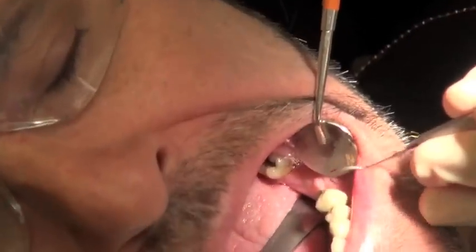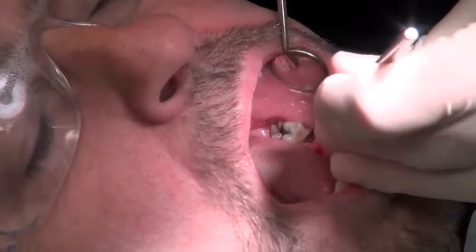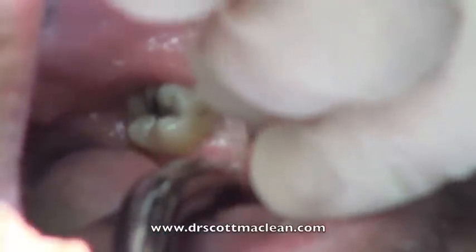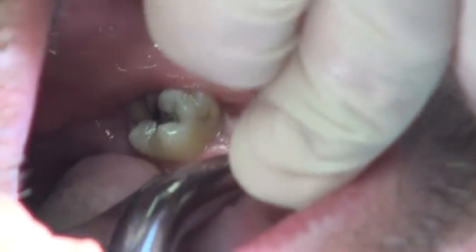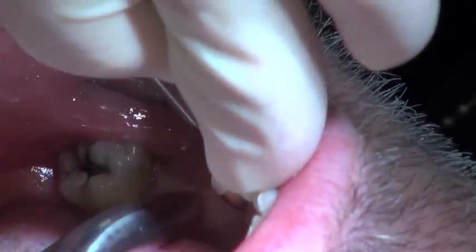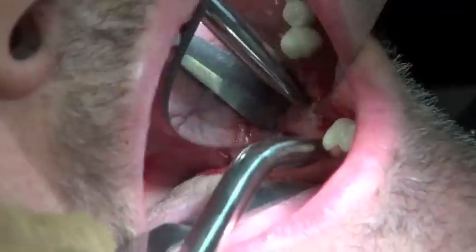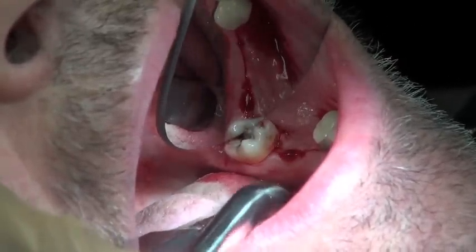I like to test the anesthetic before I start, so I give a couple of pokes before we begin surgery. Then I'll go in and flap it and get the tissue out of the way. I'm using a number 12 blade here, but you can use a 15. Cutting down to the periosteum, making sure you're pushing pressure down, being very careful to go slow, and you can see the incision line here.